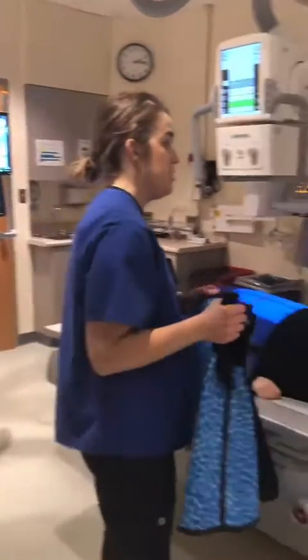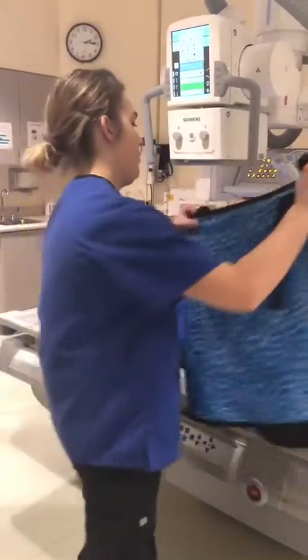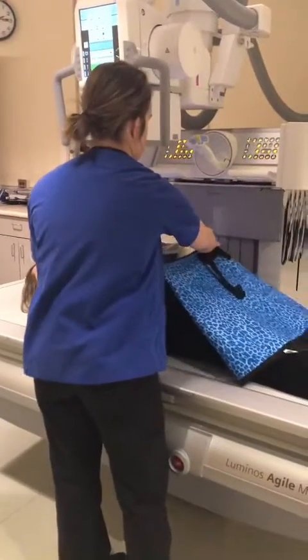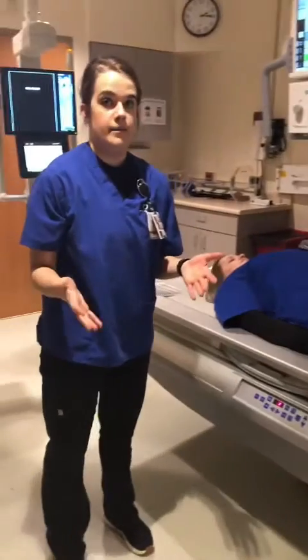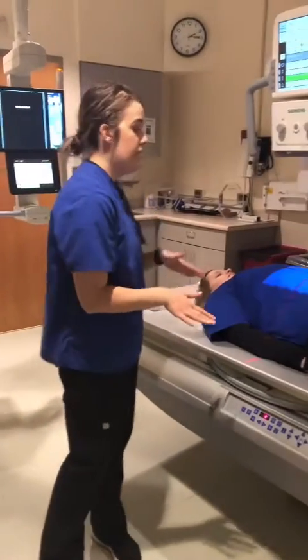Alright, next I'm going to shield the patient, so I'm going to shield any radiosensitive tissue. In this case, I'm going to be shielding the patient's gonadal region. With an abdomen, I'm going to try to get the shield as close as I can, but so that it's not in the image. So I've now shielded the patient.